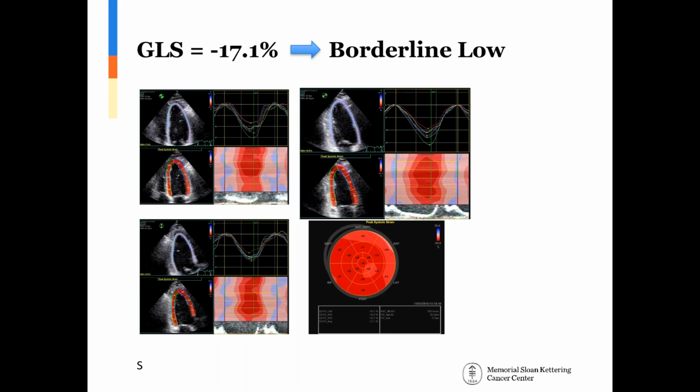What we try to do is scan this patient with some equipment that gives us better image quality. I think that our experience is very similar to what Jennifer explained. We are able to quantify strain in around 85–90% of patients, because we want to acquire images to quantify strain.